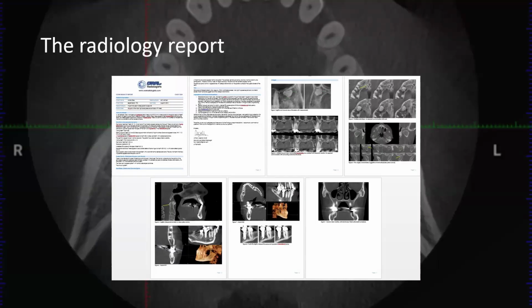So look through those, and if you see some dental finding especially, or if you see that I've seen arterial calcifications, you should be able to have a conversation with the patient and say, hey, our radiologist saw this. It's a cardiovascular risk factor. Just tell your doctor. At Boston University, we used to send them a letter. Maybe that's a little overboard, but the letter at least would have a description and they could take that to their doctor. They need to know there are arterial calcifications, so calcifications in my artery. That's a risk factor, and their physician should know what to do about that.